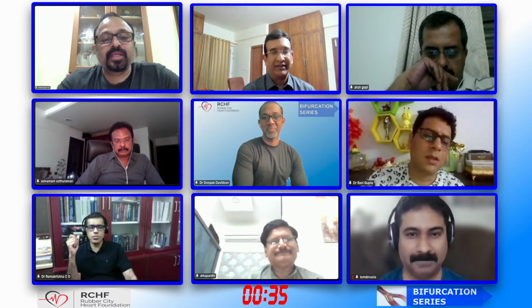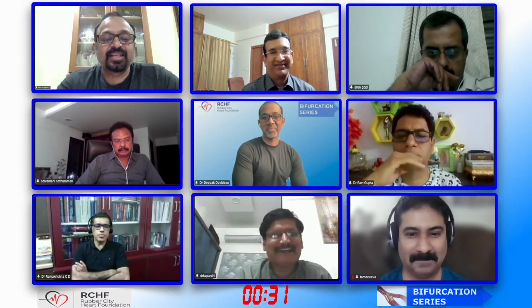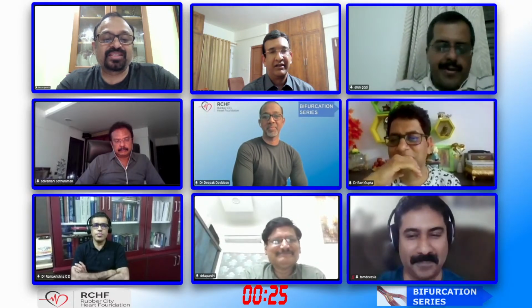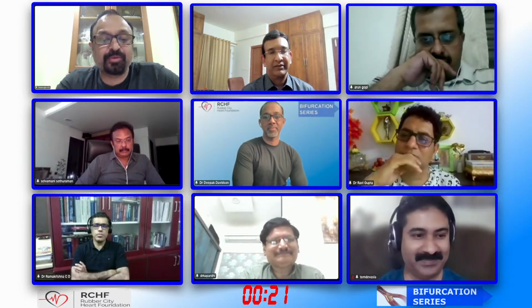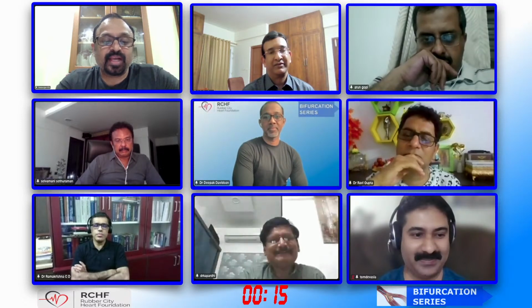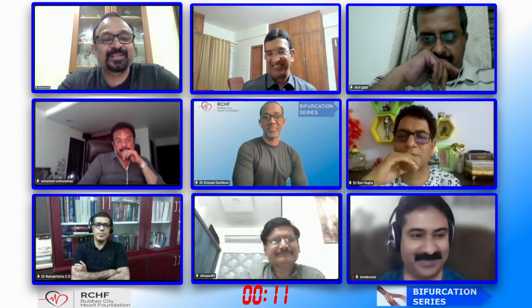Maybe because of economic reasons. The need for multiple new balloons, etc., may be playing in the mind of operators, for example in our country, where instead of DK crush, they may be doing a mini crush technique. Mini crush. Yeah. Unless you deal with very affording patients like how my good friend Deepak has.